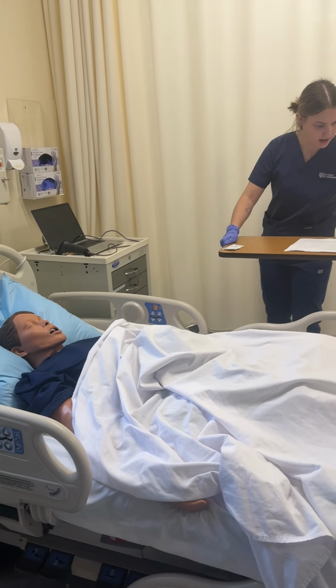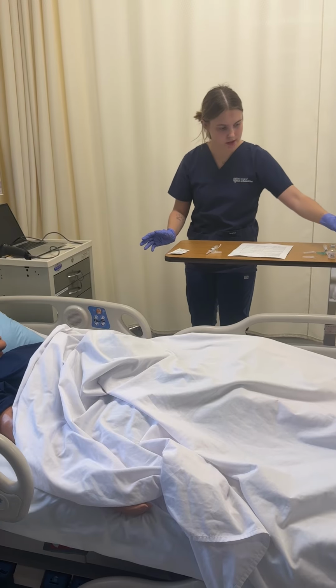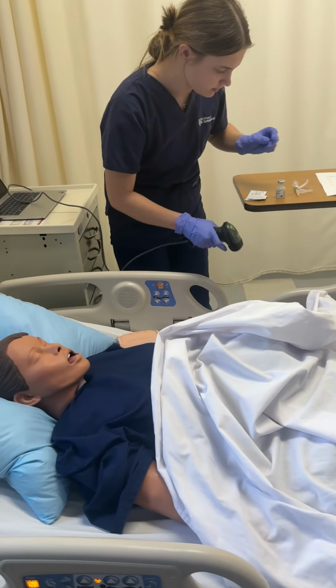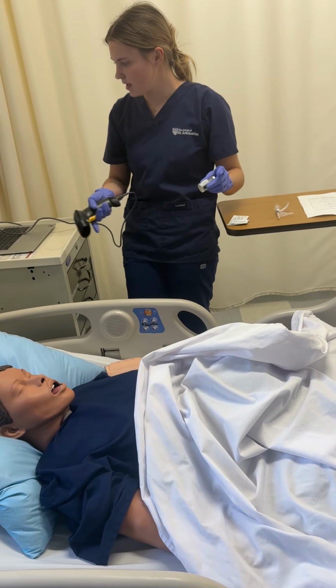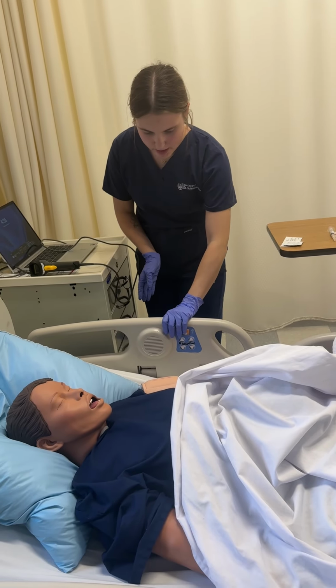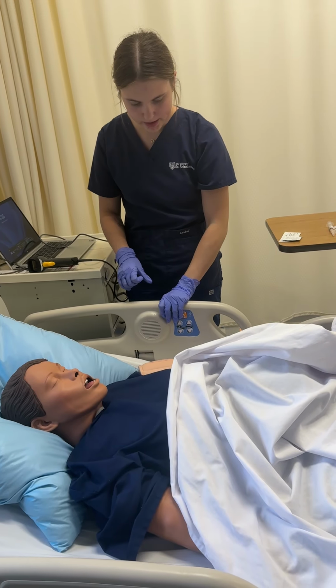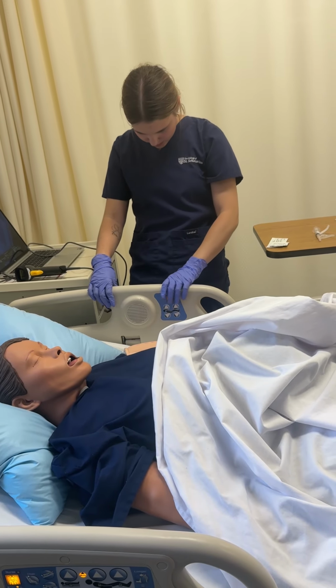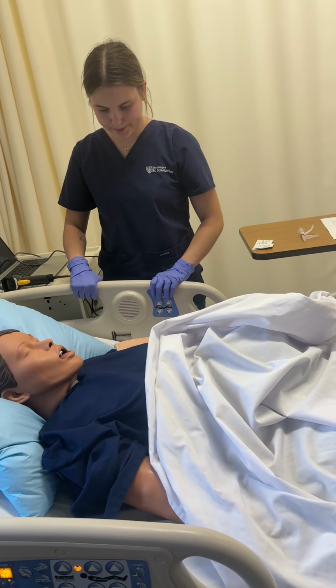So, we're gonna do the Fluzone first. So we are going to scan our patient's wristband here and scan our medication, and it was a match. Sam, I'm gonna sit the head of your bed up here a little bit. Put your head up just a tad bit.